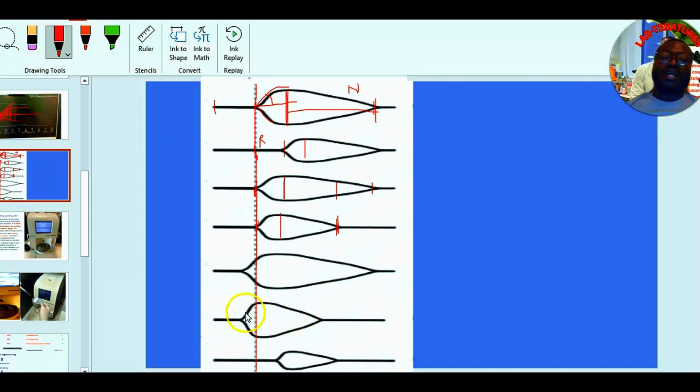And remember, if you are in the first stage of DIC, for instance from a snake bite that has caused your system to form a clot and break it down at the same time, as it progresses to the next stage, your clotting factors are insufficient because they've all been used up in this initial clot formation. So now you are clotting factor deficient at this point, and it is prolonging the reaction. And as it prolongs, you are still lysing the clots, and this is the second stage of DIC.